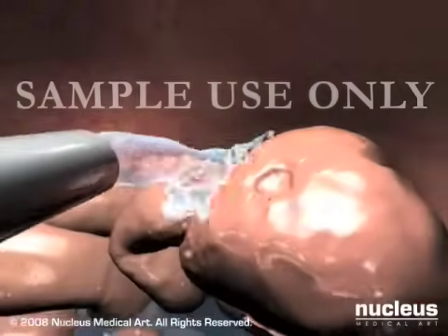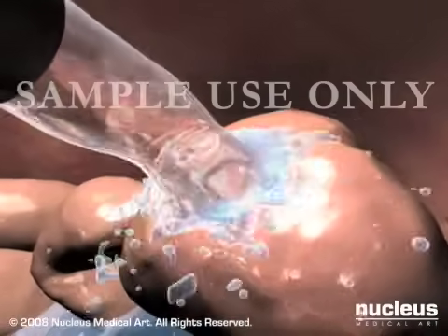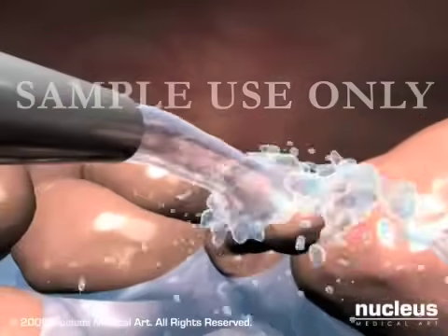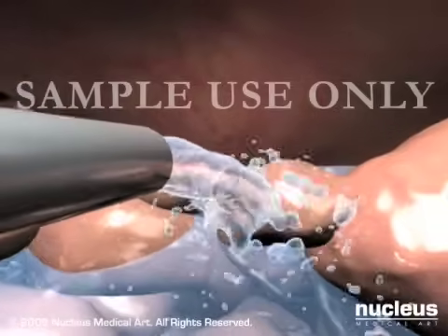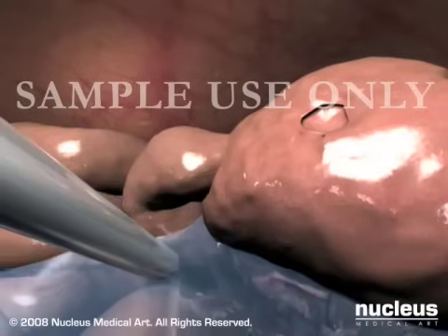After your appendix has been safely removed, your surgeon will instill warm, sterile salt water through one of the ports into the abdomen to cleanse the abdominal cavity and remove any traces of infection. The salt water is then suctioned out.